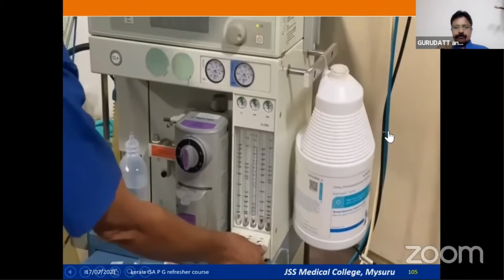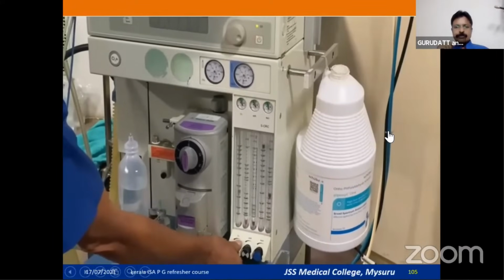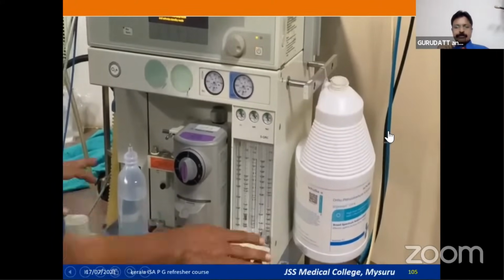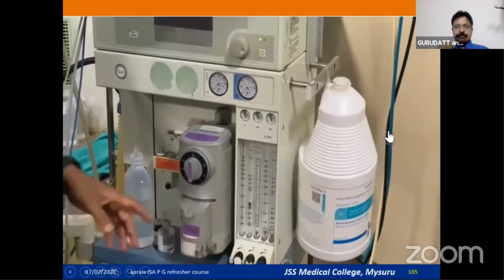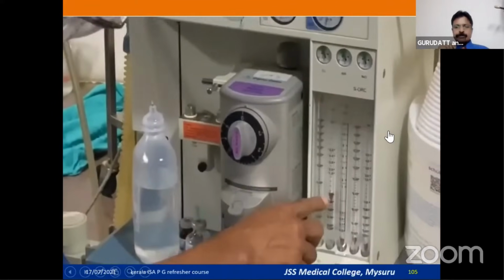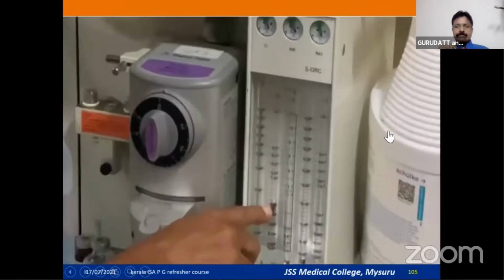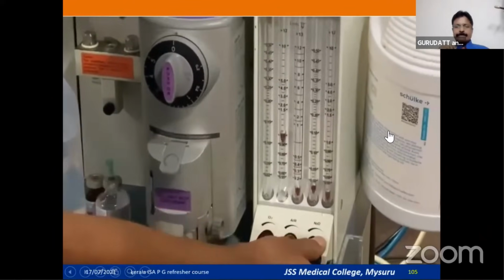So that is one of the things which is very important. Now if I am opening oxygen, I can only open oxygen. Nitrous oxide initially it has come up, but it has fallen. So I can give only oxygen here. Now let us see that I am giving 1 liter of oxygen here. So you can see, sorry, this is 1 liter of oxygen, right? So I will try to open nitrous now.